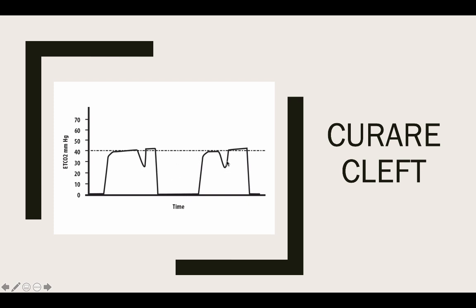And it takes another breath. What this tells us is we've got expiration, and then this negative deflected line is a little bit of an inspiration. So our patient just inspired a little bit, and then didn't. And then they expire, and then inspire a little bit, and then didn't.